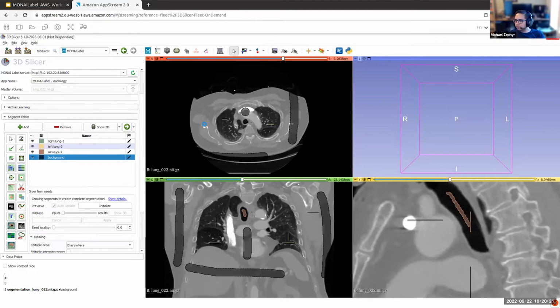The only question, yeah, I'll say there's one question with people having an issue connecting when they actually use the MONAI Label extension and connecting to their server. I would say make sure that you are copying and pasting it correctly, and there is the HTTP:// and your IP address, similar to what's showing in that MONAI Label command console that you're using to get your IP address.